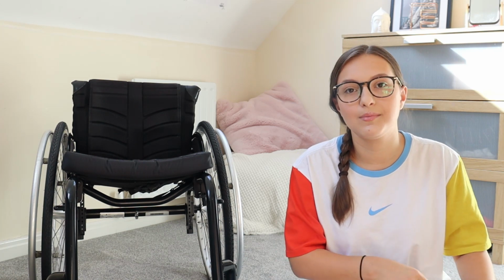So I decided to go out and buy a second-hand wheelchair, as I don't use it 100% of the time, so it doesn't matter to me if it's a little bit worn, and to be honest, I'd rather save the extra grand. Now a really good tip for if you're looking to buy a wheelchair second-hand is to go to a wheelchair showroom and actually sit in different types of wheelchairs, different sizes, to see what you like best. Because with a second-hand wheelchair, you're not always going to be able to go and try the wheelchair before you buy it. So before I chose the wheelchair and knew the sizing that I wanted, I went to a wheelchair showroom near me.